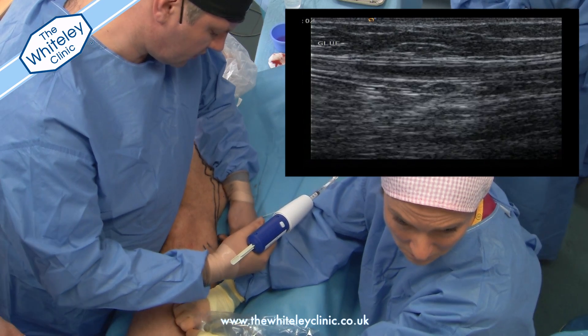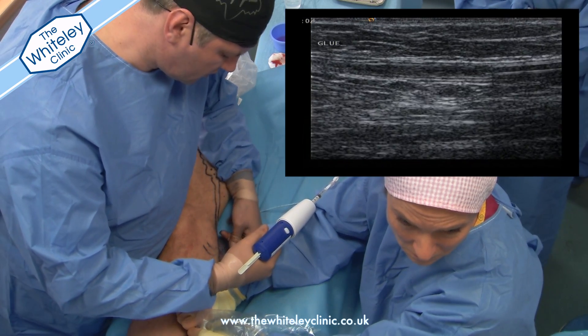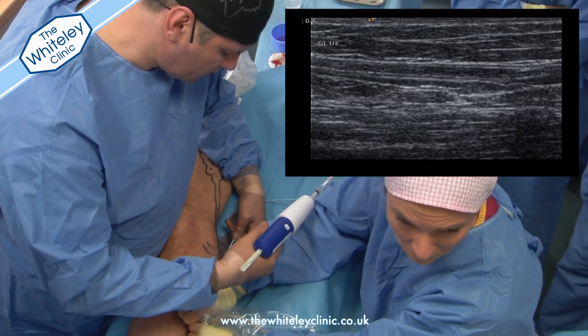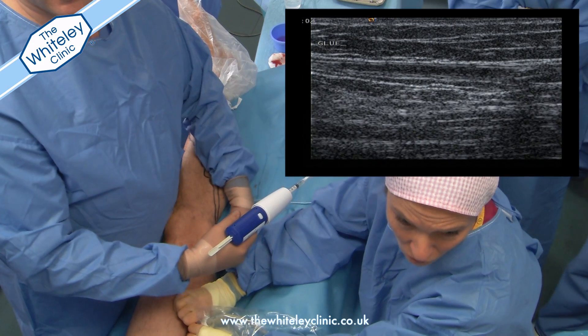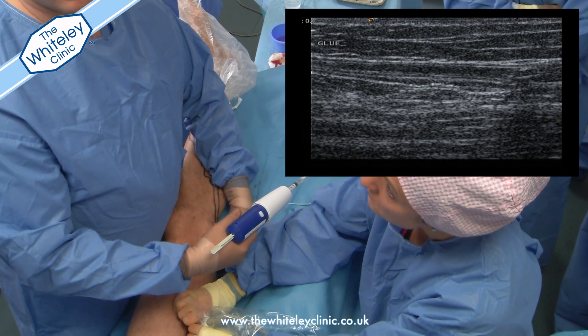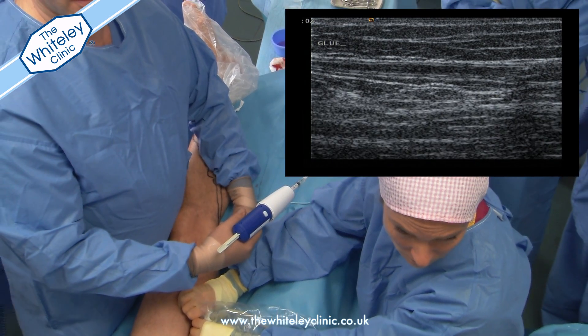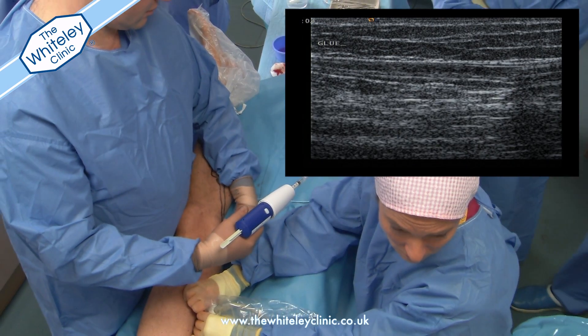Once the top of the vein has been stuck together, we want to stick the rest of the vein together to get a complete treatment of that section. Therefore, using little blobs of glue, we pull the catheter back at exact rates and exact times to make sure the glue is evenly spaced all the way down the vein.